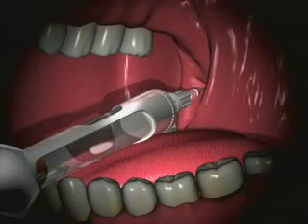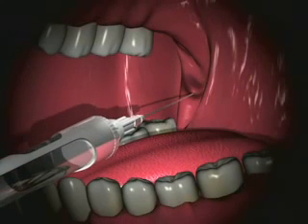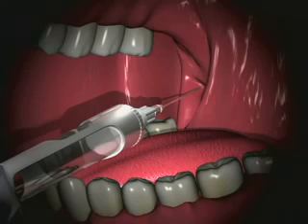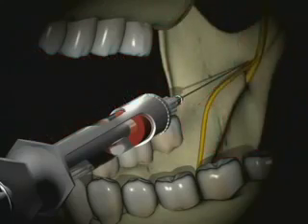If you do not contact bone after 25 millimeters, and the needle is almost buried, you should redirect by withdrawing somewhat, but not completely, and move the barrel of the syringe more laterally and advance again until bone is contacted. You should repeat this procedure as necessary.